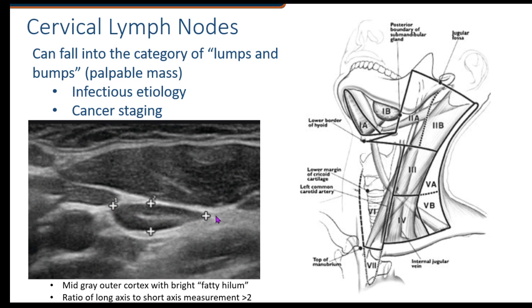These calipers are here to demonstrate what we consider a normal lymph node. When we look at the lymph node and measure its longest length compared to its AP or width, we want the ratio to be greater than two. So the long axis to short axis measurement greater than two indicates a normal lymph node.